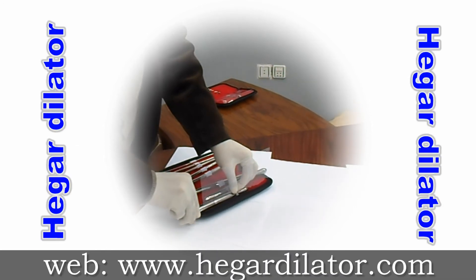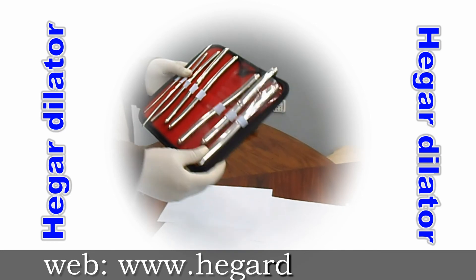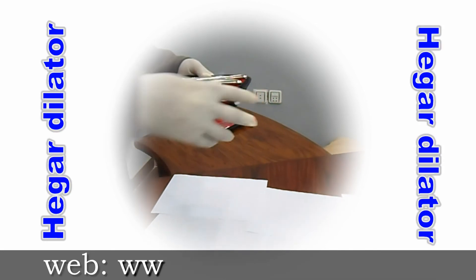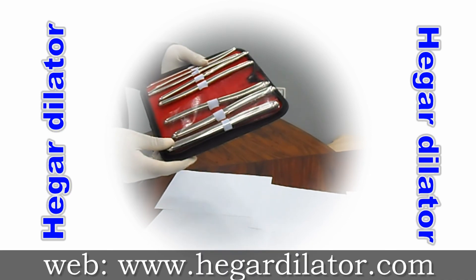This is a high-grade stainless steel, non-magnet, packed in a nice zipper leather velvet case. This is a very nice quality. Thanks for buying on the Hamza store.